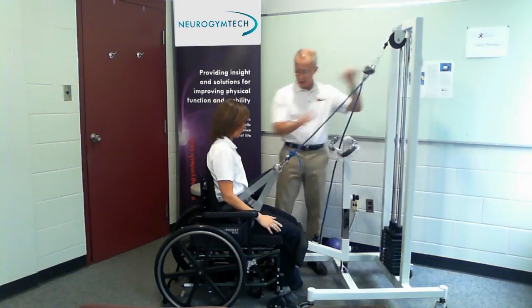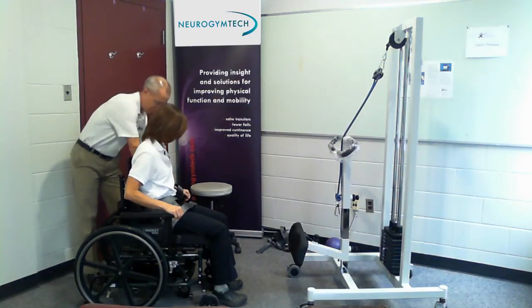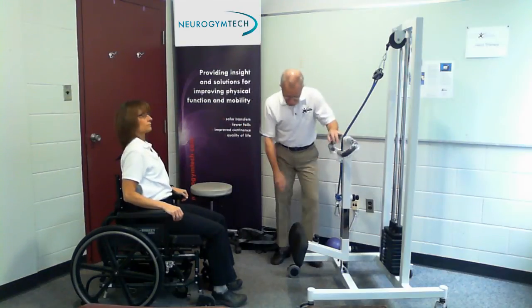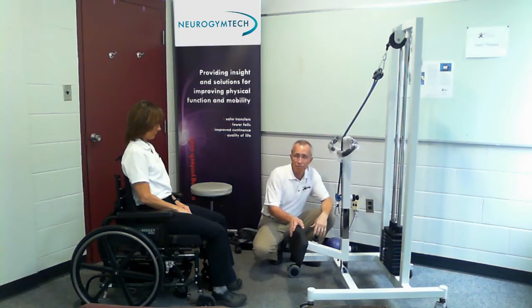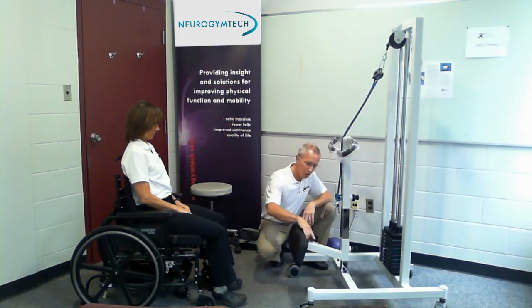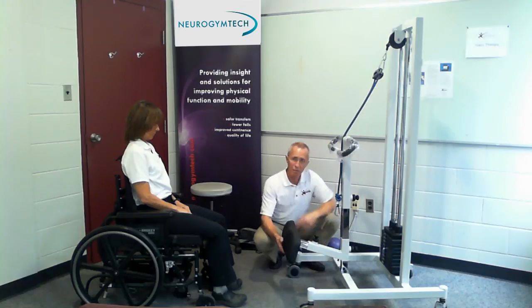Now let's start breaking it down to the different functions and show you the different adjustments of the machine. First of all, there are locks — these are standard locks for any medical piece of equipment. You flip them up to open and down to lock. They're locked about 90% of the time. There are three adjustment knobs and they all work the same. There's a large round circle that is only meant to be a half-turn one way or another, either to loosen or tighten. There's also a plunger on top that enables the piece to slide, and then as it slides the piece locks back in.